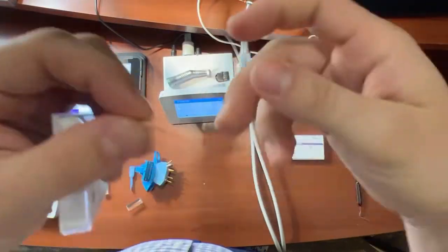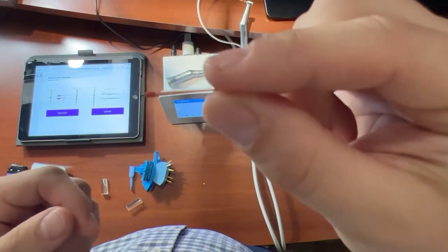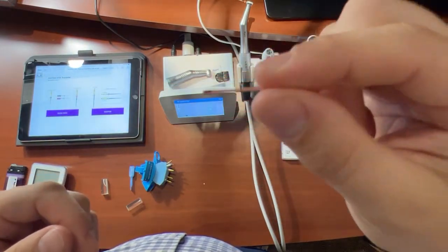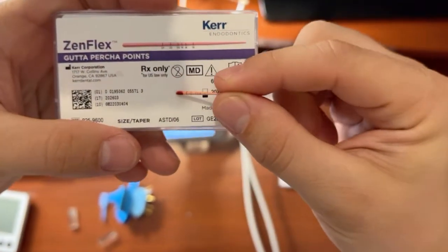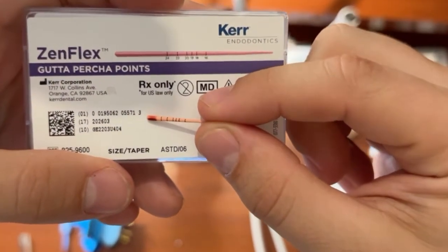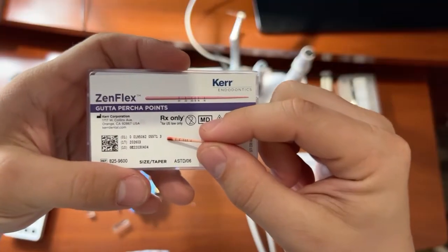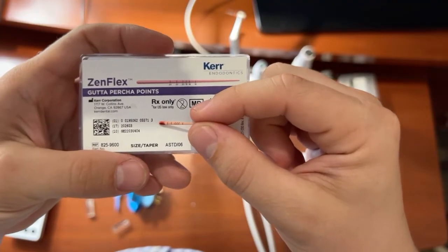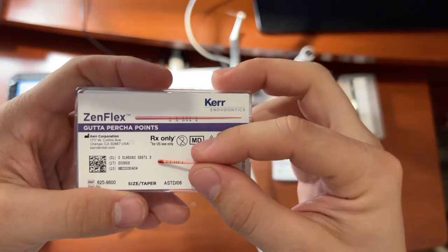So you can see right here, it has all of those little scores. It's harder to see there, but it has all of the little scores on it. So you can take your cotton pliers and grab that right at the perfect length that you will need to put into the canal.